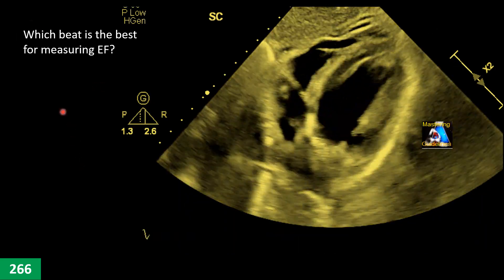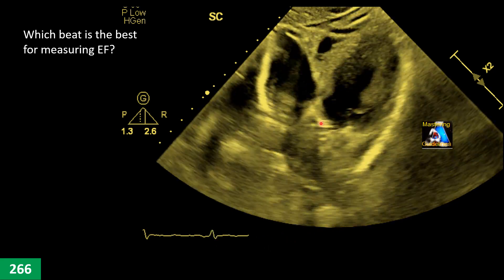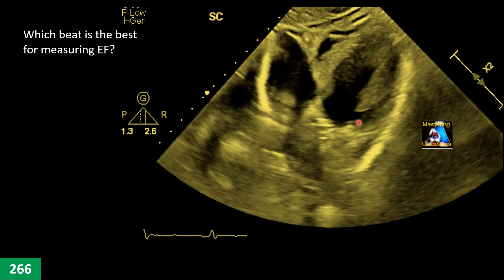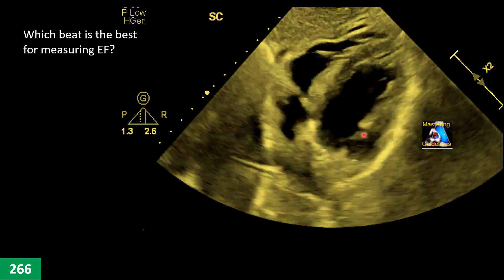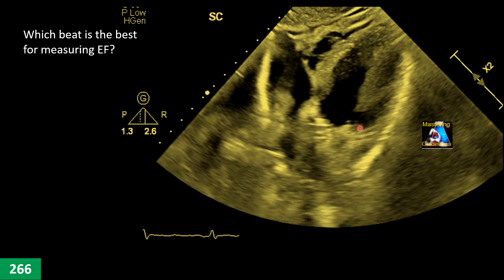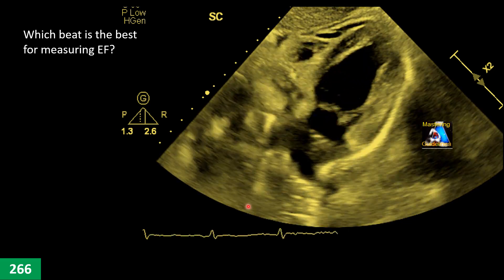Here we have another subcostal four-chamber view with three beats, each showing a different view. Which beat is best for picking up and tracing the endocardium for measuring ejection fraction, and what are your landmarks for selecting that beat?